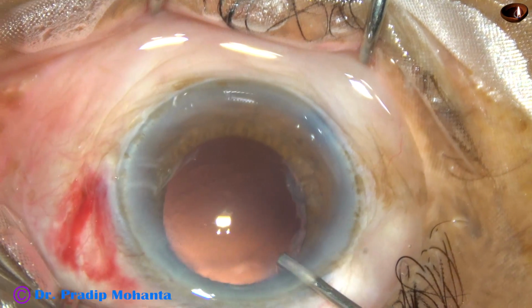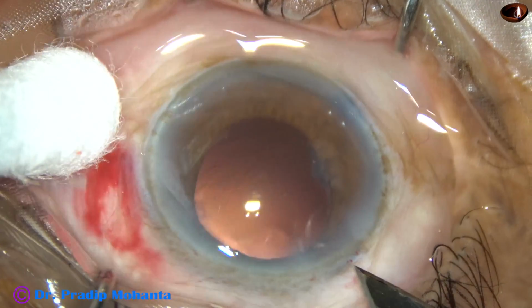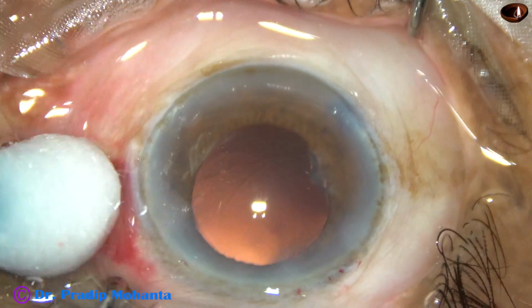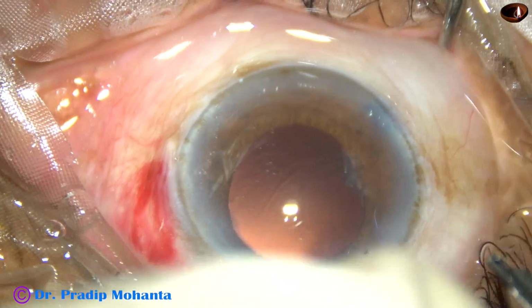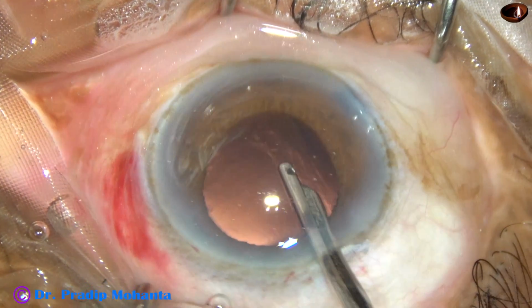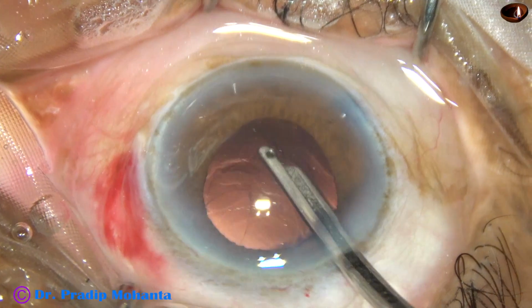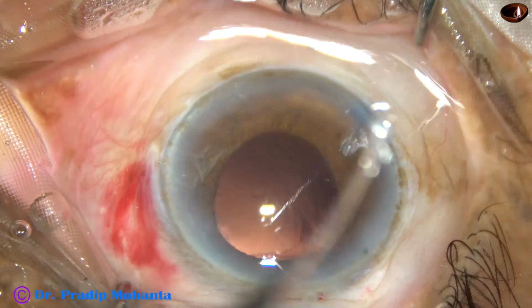And now this is SPMC again, and in this case I find that there is very little cortex. Enlarging the main wound a little bit by 0.2 millimeter, making the incision 3 millimeter because I am going to use a B cartridge. So whenever you use a B cartridge, please enlarge the main incision, otherwise it may be difficult to deliver the lens into the capsular bag. Yes, there is very little cortex and that has been removed by this 23 gauge Simcoe cannula.